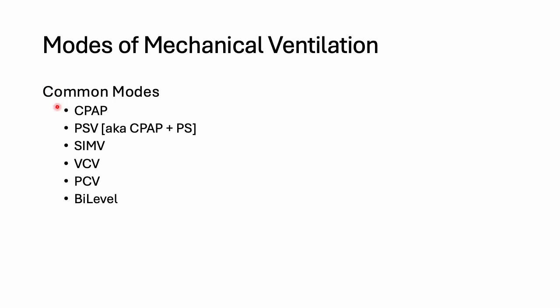On different ventilators, a descriptor for that mode may mean the same thing as on another ventilator with a different descriptor, but they may all refer to, say, pressure support ventilation. That's just an example, because of commercial reasons.